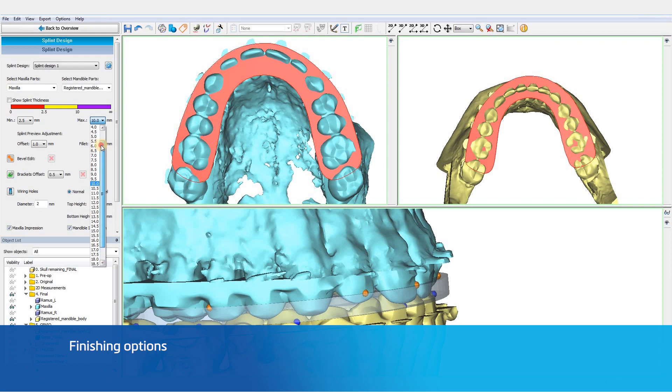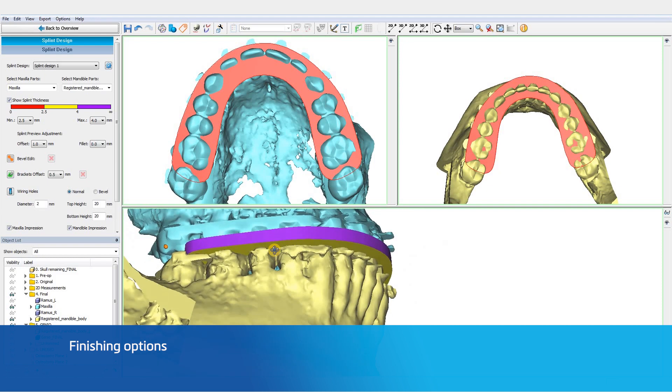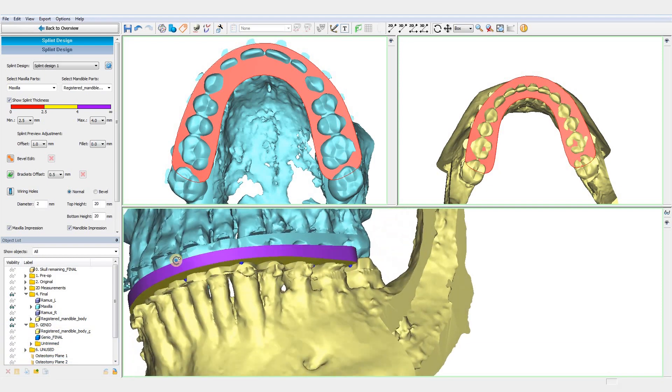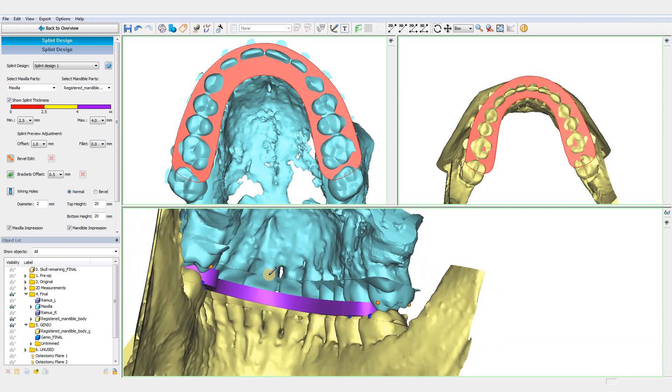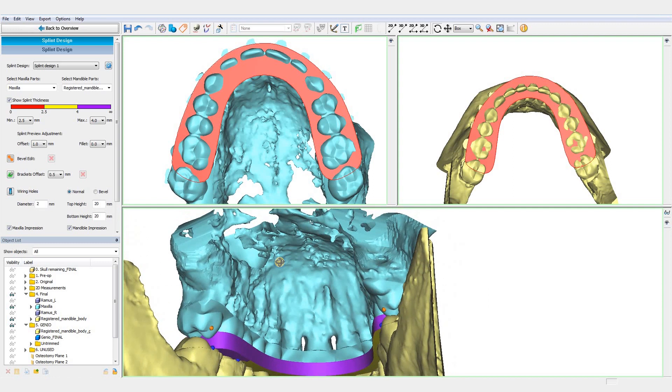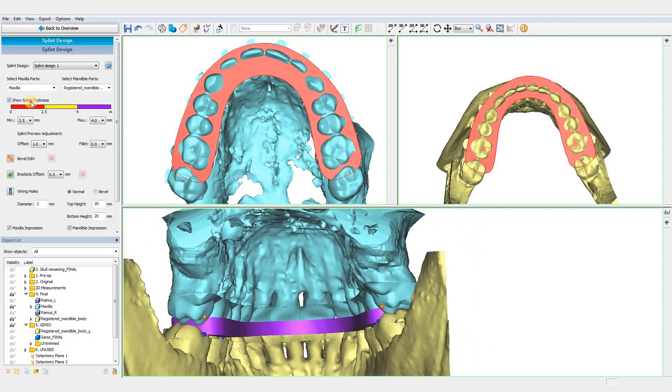When we are happy with our splint design, multiple finishing options are available. We can analyze the splint thickness by toggling this box and check if it is in a reasonable range. Take into account that very thin regions might not print.